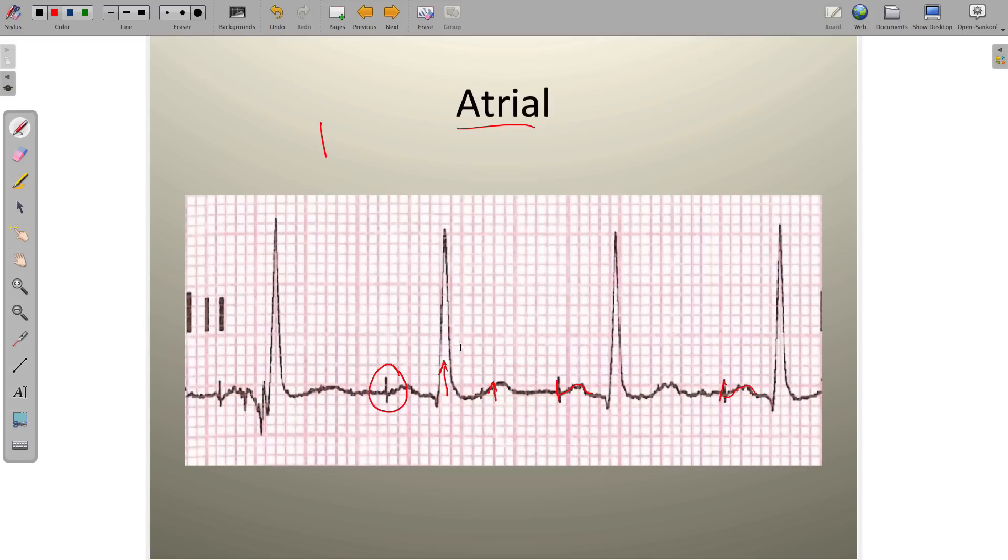That's about all we can tell from this particular tracing. For atrial pacemakers, look for the spike — it's a rapid, single moment in time event — followed by a P wave. Then the QRS and T wave must be of normal duration and both must point in the same direction. This is really important.